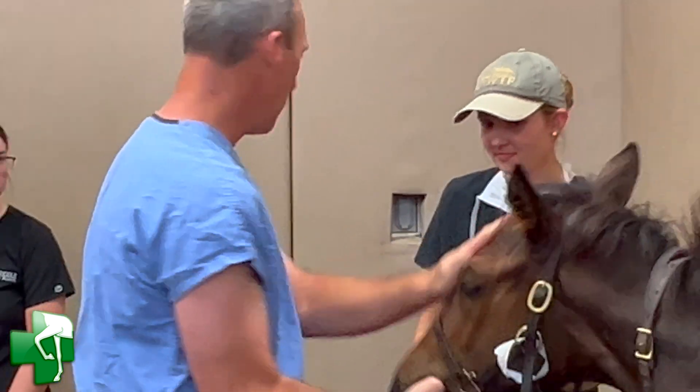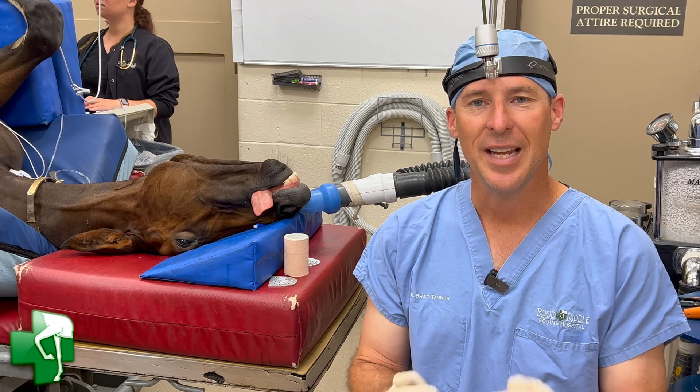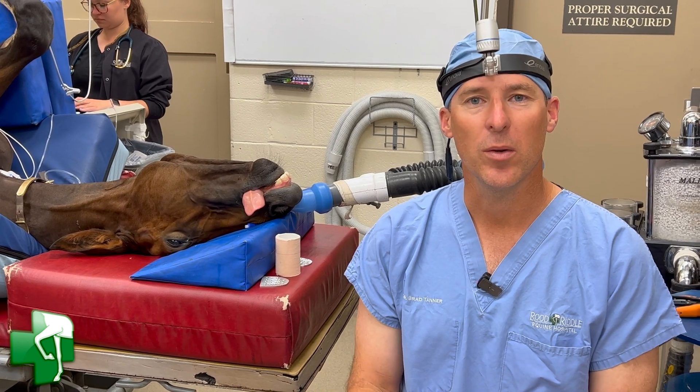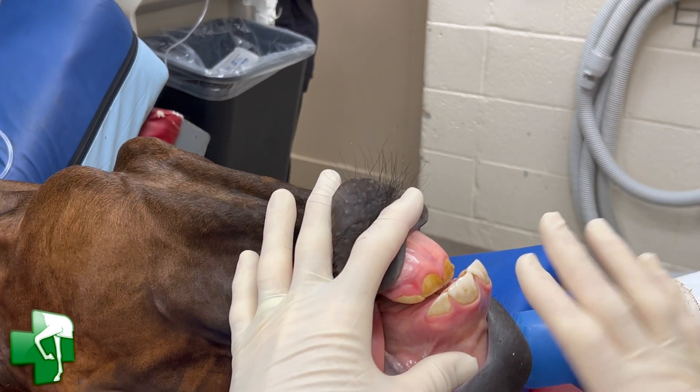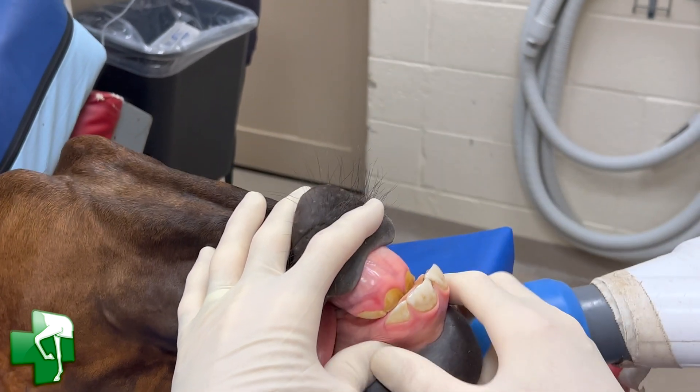By correcting early while they're developing, we can slow the growth of the top jaw and allow the lower jaw to grow. As you look here, the horse is upside down — so the top teeth are in the bottom of the picture, and the lower teeth are in the top of the picture, so everything's reversed.